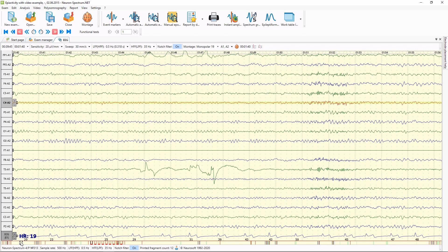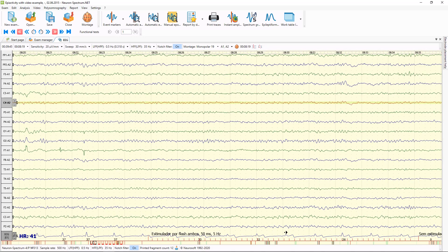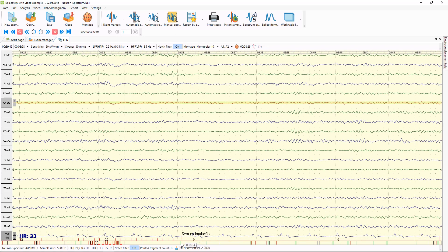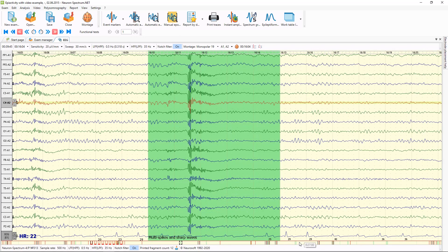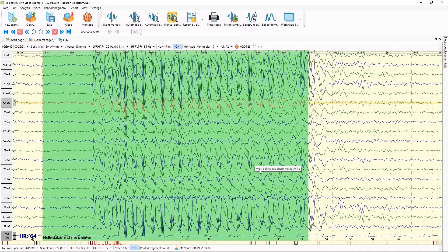Also, under the traces you can see the navigation line where all episodes are marked with red lines, and you can navigate between them with a mouse click. Here is the stimulation episode, here is the multi-spikes episode, and here is the epileptic seizure episode.